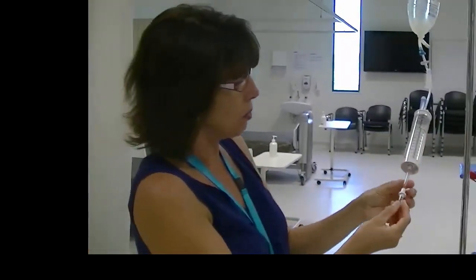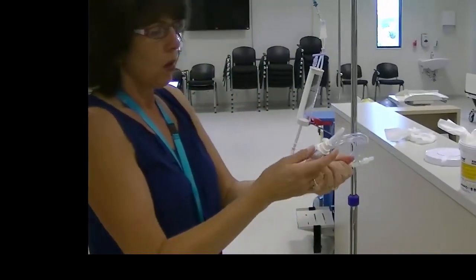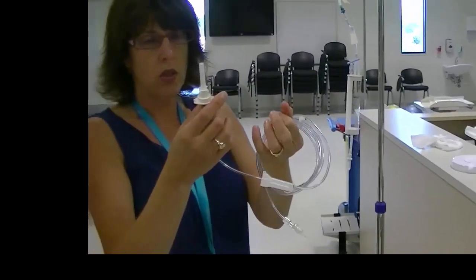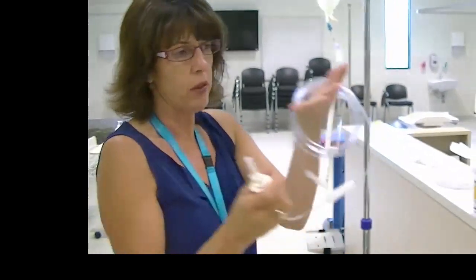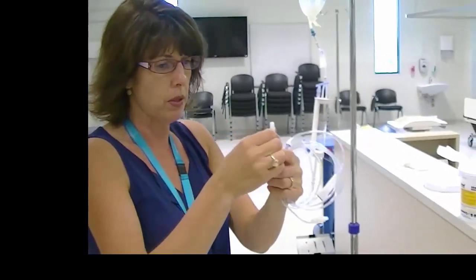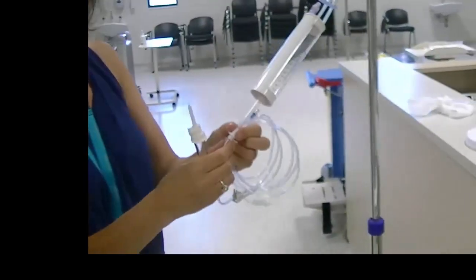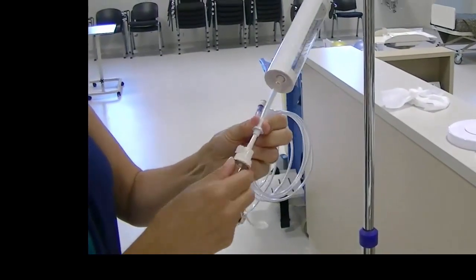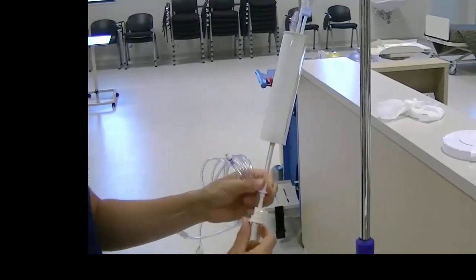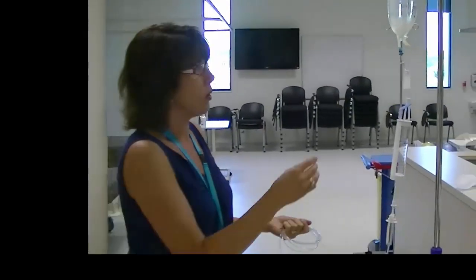Okay, this end of the burette's still got a cap on it, so it can't be contaminated. When I pick up the IV line, I do not undo it. I can hold it in my hand, or if I rip the paper tape off, I still hold it in my hand. I don't drop it. Once again, not touching the spike. And give it a bit of a twist. Okay. Right, now we're ready to start filling with fluid.